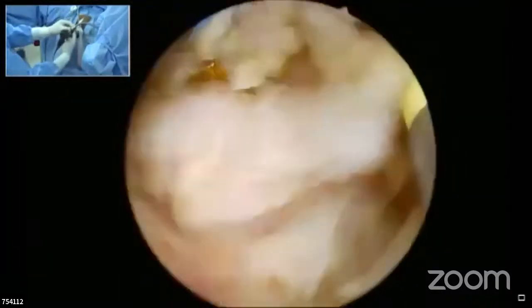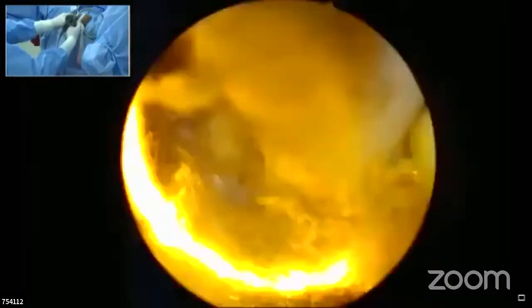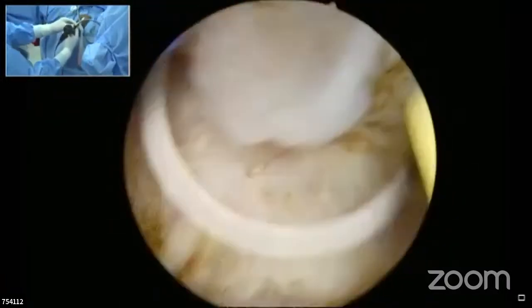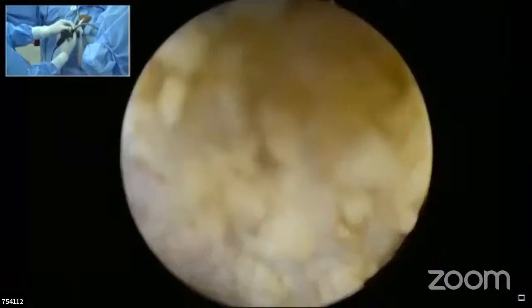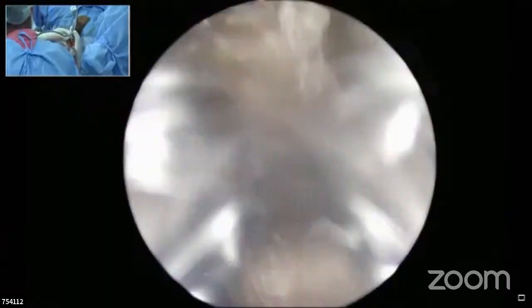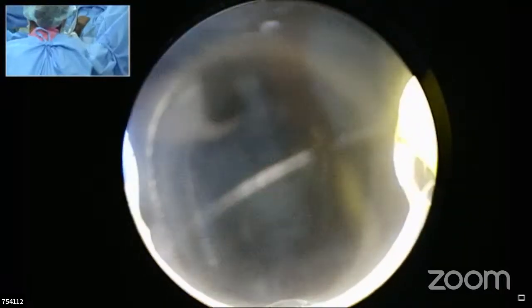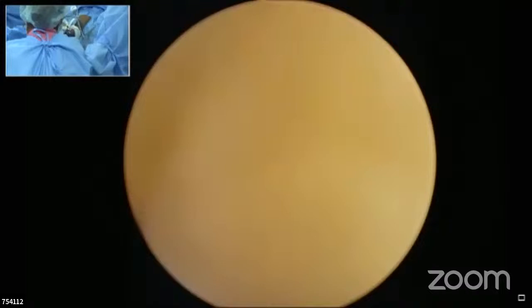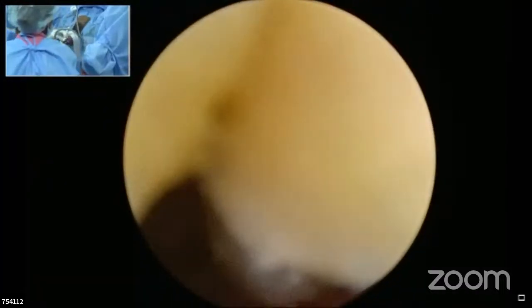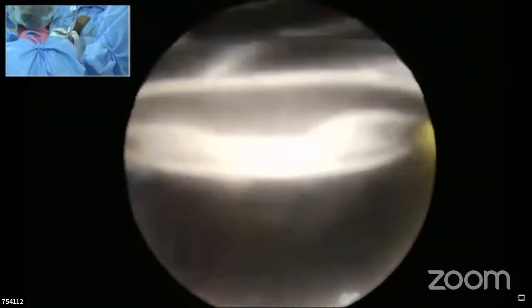And also it is better to do an interruption once, so that the intravesical pressure in the bladder comes down. Sometimes, you never know, your outlet may be blocked or something, then things may go haywire here and there. So safety is more important. You can wash once, there is no problem. And even with the Ellik, you can evacuate the chips also. Whatsoever comes out, then you can go back and look again and start again with fresh anatomy.